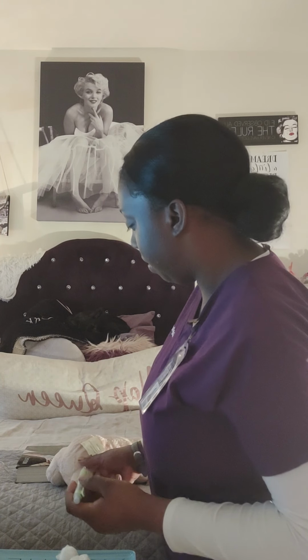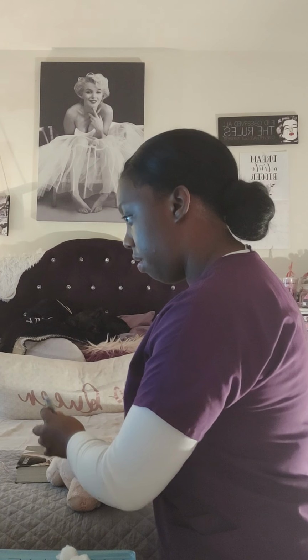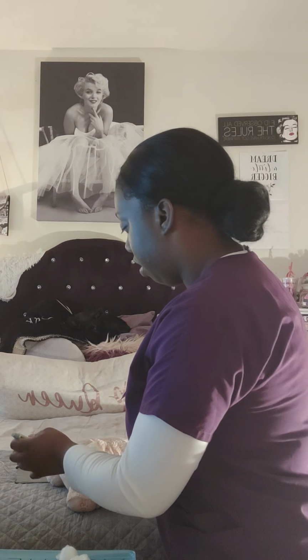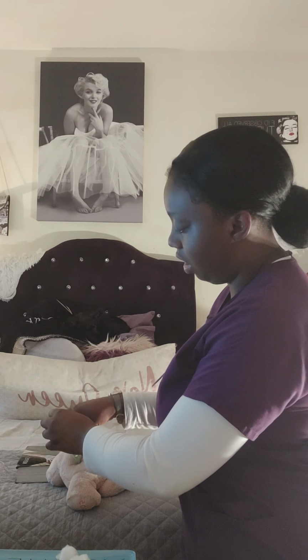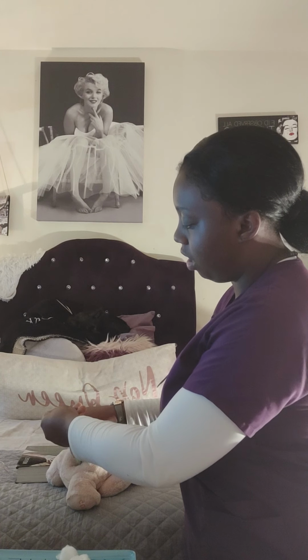Then we're going to do the same thing that we did by pulling the skin. Encourage the patient to relax the muscles. Then with the darting motion, we're going to inject the needle at a 90-degree angle. And then this is where the aspiration part comes in. While we are getting the needle injected, we're just going to stabilize the needle and pull the plunger up.